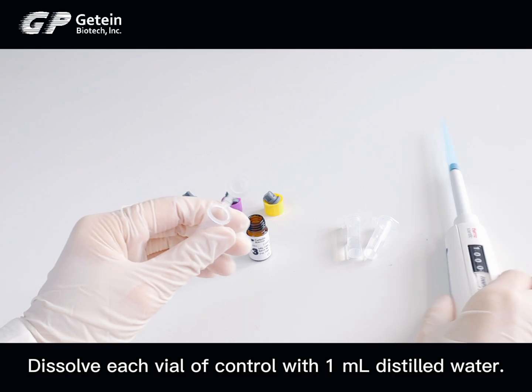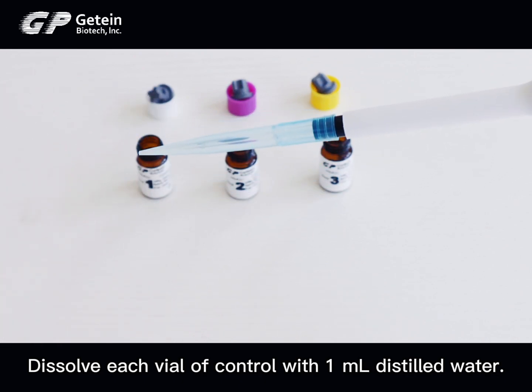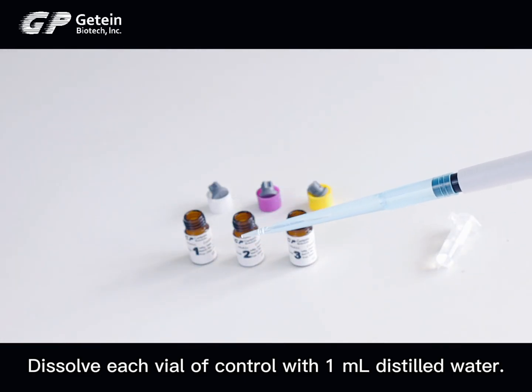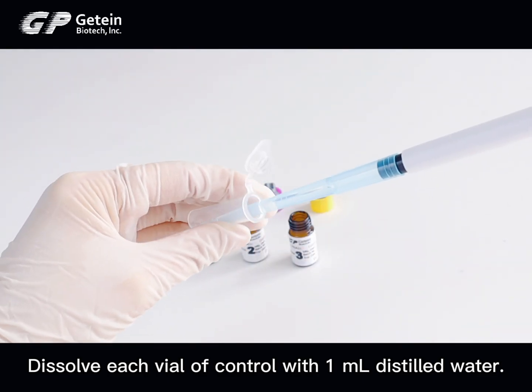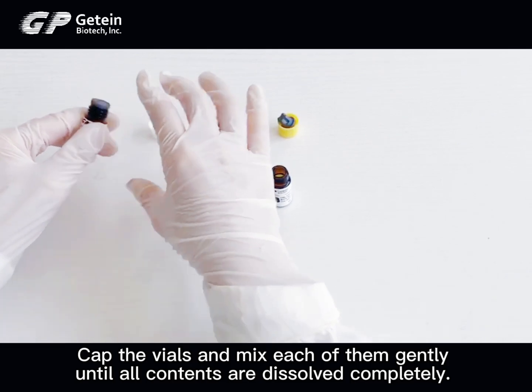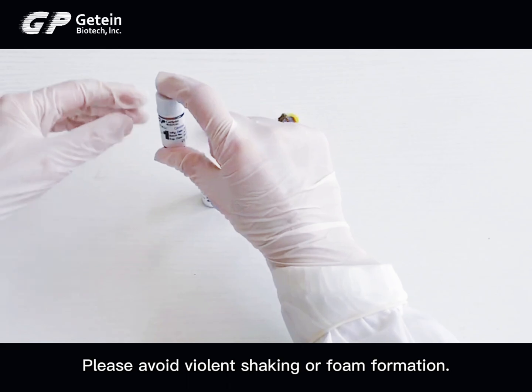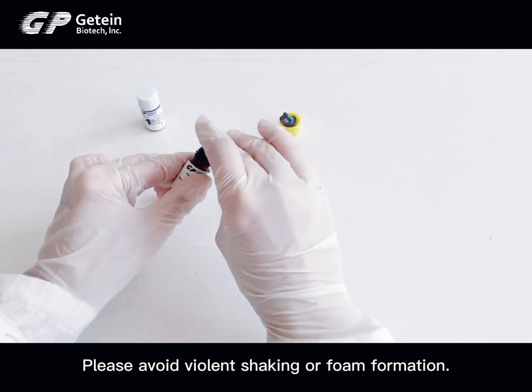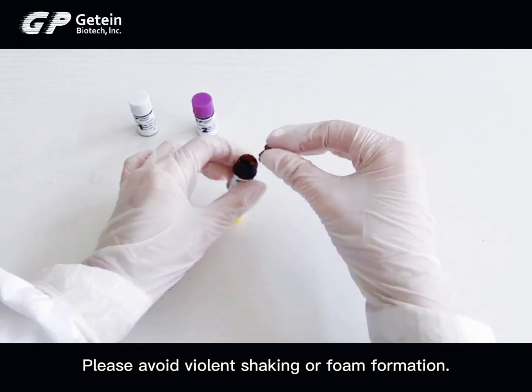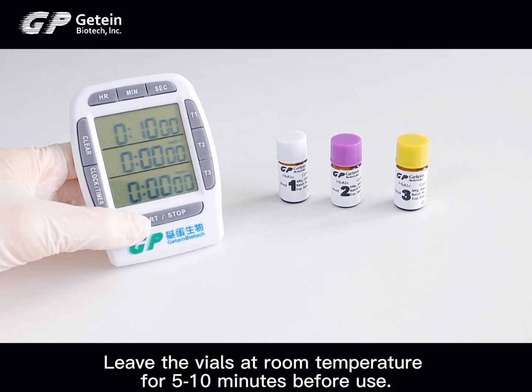Open the valve carefully to avoid powder ejection. Dissolve each vial of control with 1 mL of distilled water. Swirl the vials and mix each of them gently until all contents are dissolved completely. Please avoid violent shaking or foam formation. Leave the vials at room temperature for 5 to 10 minutes before use.